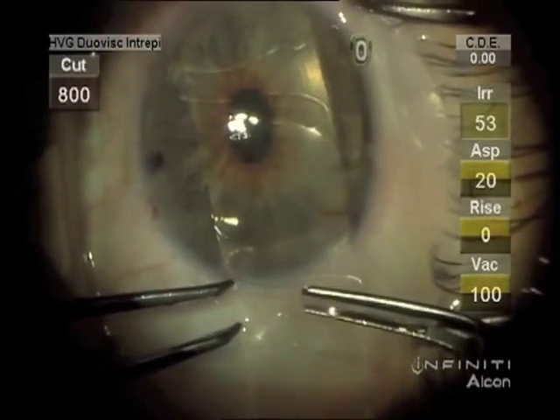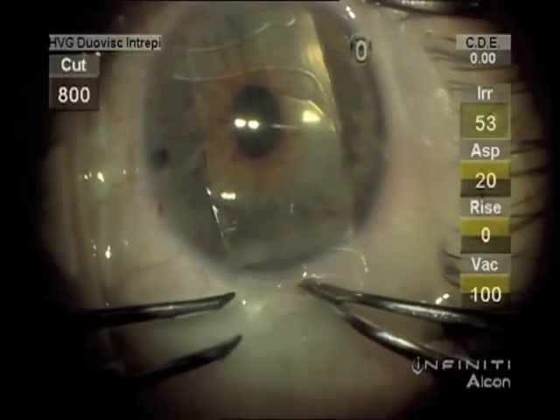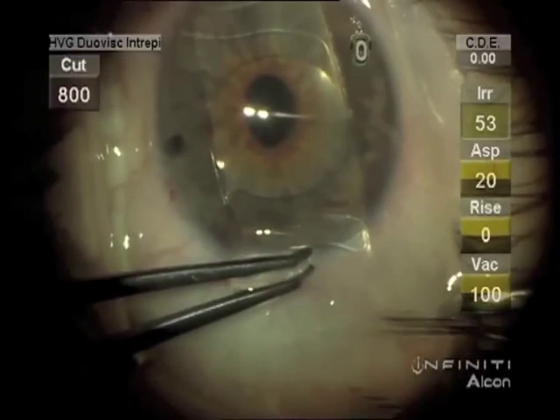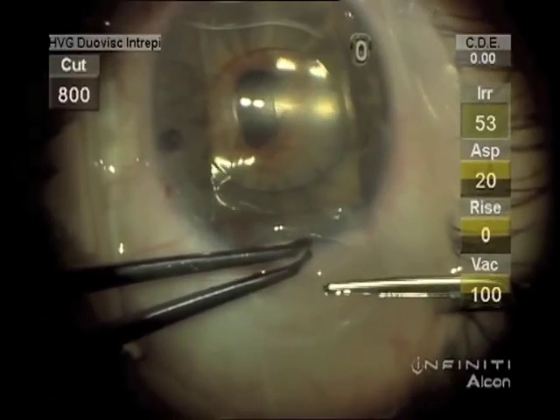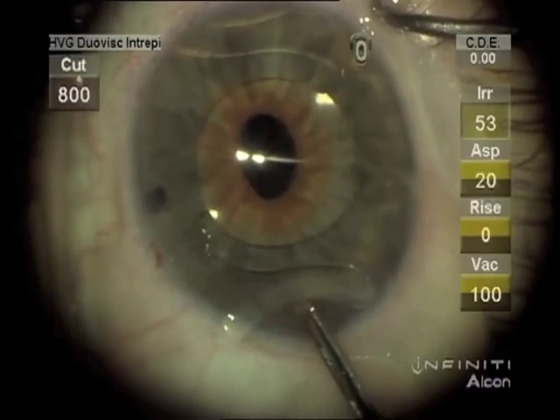One has to be careful the lens glide isn't pushed too hard with the friction from the IOL. Keep watching the pupil, and if it's ovalizing then pull back on the lens glide a little bit. I hold the lens now while we remove the glide so it doesn't pull the lens back out.